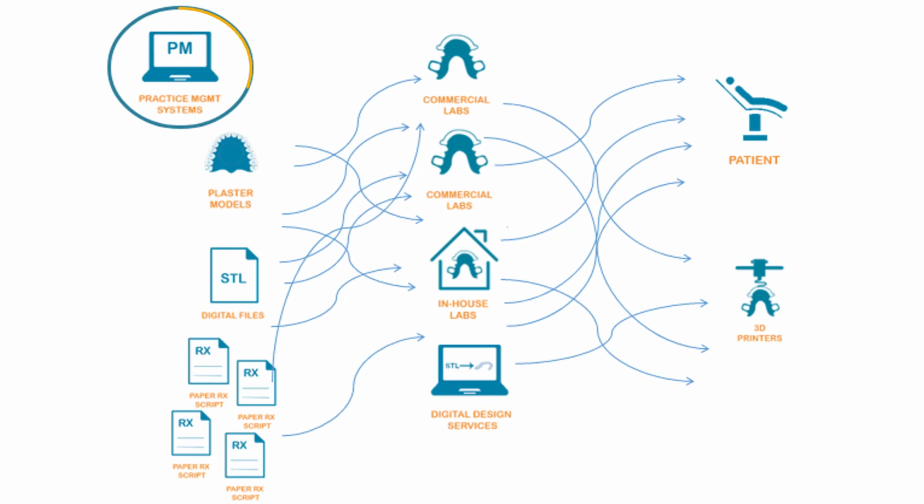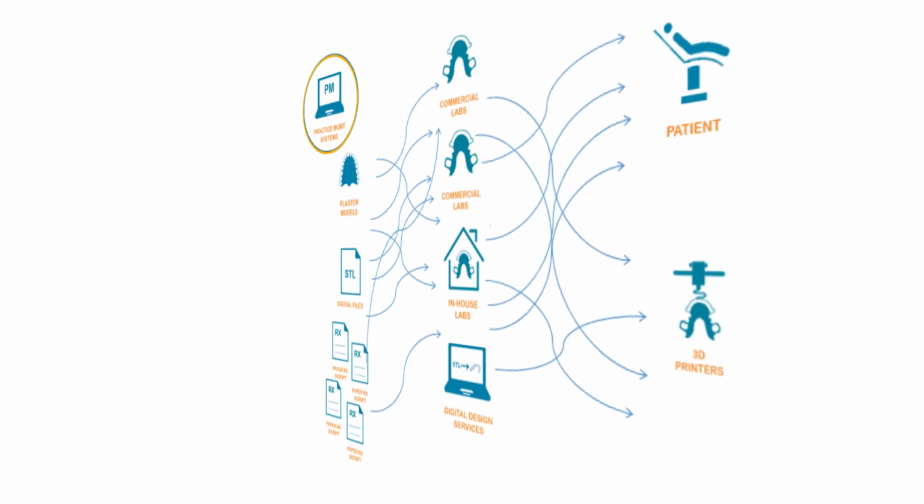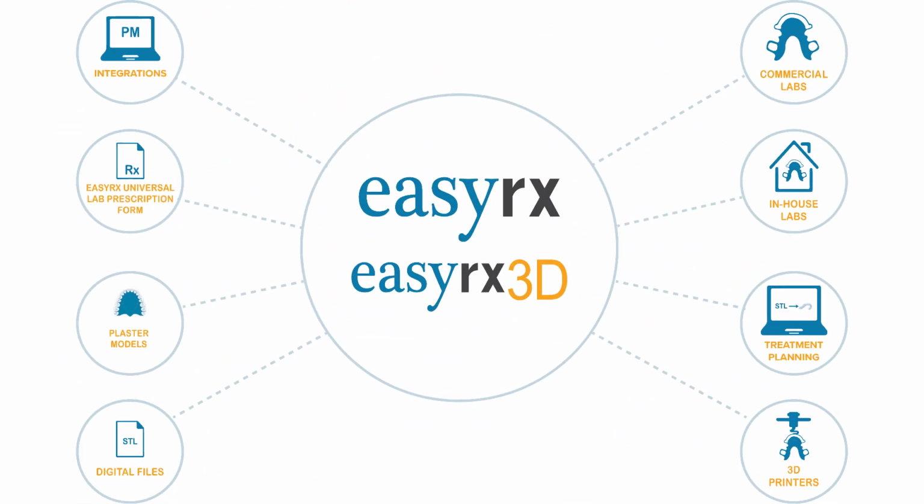And your practice management software is left out of the equation entirely, so you have a disconnect between your practice management software and your lab prescriptions. That's where EasyRx comes in. We are taking all of the different elements of your lab prescription workflow and bringing them together in one cloud-based software, building the ultimate digital workflow for your practice.